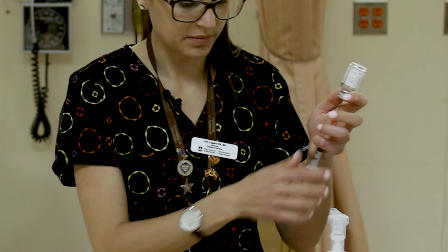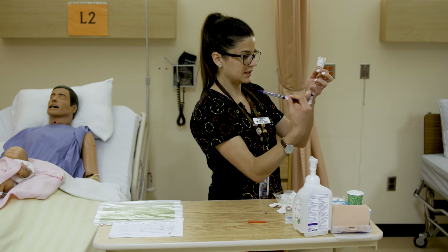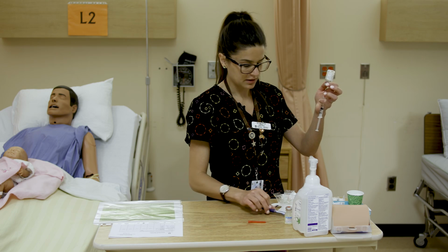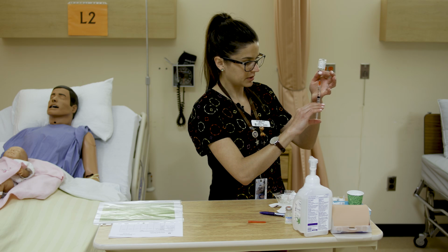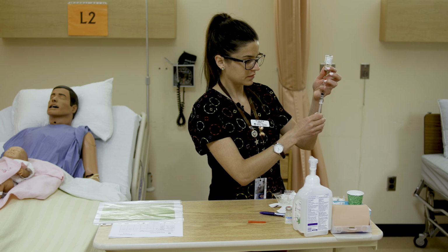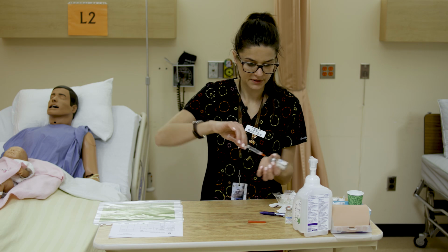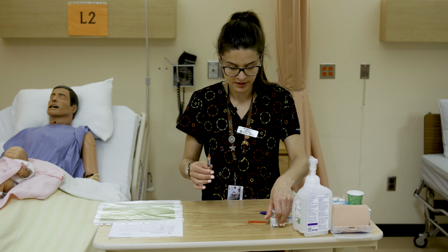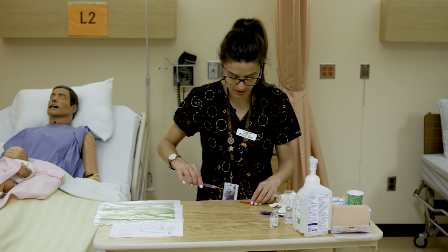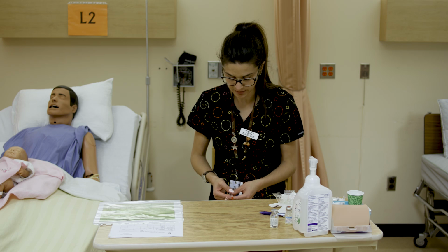And we're going to give it some taps here while it's in there, or we could take it out and take out a little bit of extra, but that was pretty straightforward to get the bubbles out. So we're at 2 mLs of our ampicillin. We'll remove it. We'll recap before we remove our blunt fill.